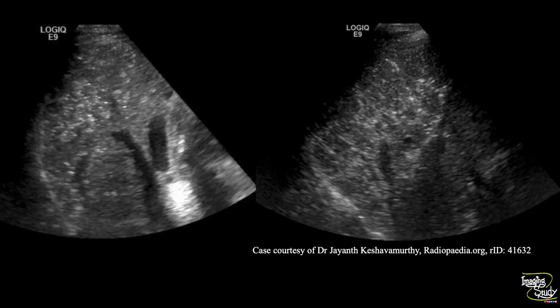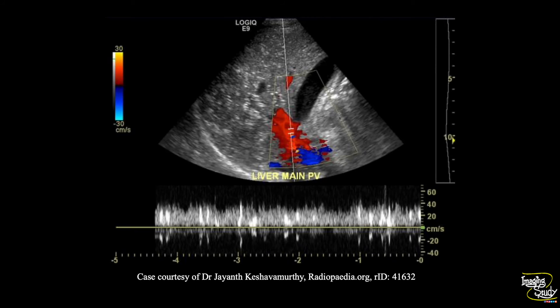Here is another case showing bright echogenic patches in the liver more peripherally, representing parenchymal gas. On pulse wave Doppler, you can see the spikes again in the same direction as portal venous flow, indicating portal venous gas.